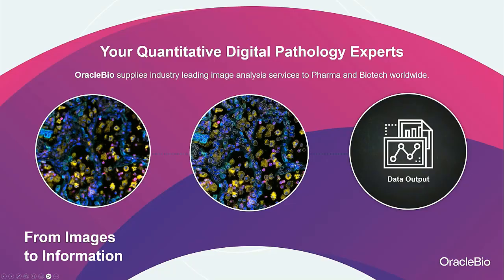OracleBio is a contract research organisation specialising in digital pathology, and we undertake a range of image analysis studies to ultimately generate relevant and accurate data. We use client-specific images to develop our algorithms, which are tailored to the individual project needs, with a view to quantifying the staining and producing high-quality data readouts. We have an ever-growing team of expert image analysts supplying industry-leading image analysis services to pharma and biotech worldwide.